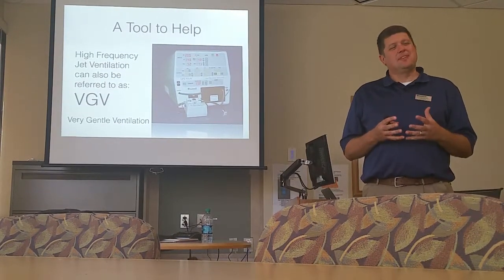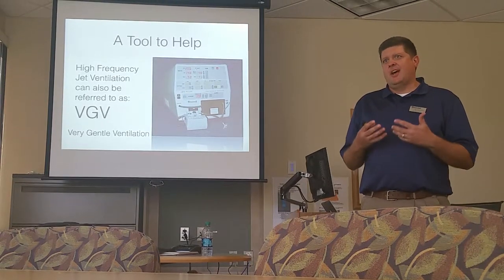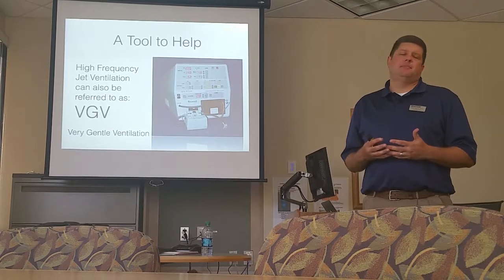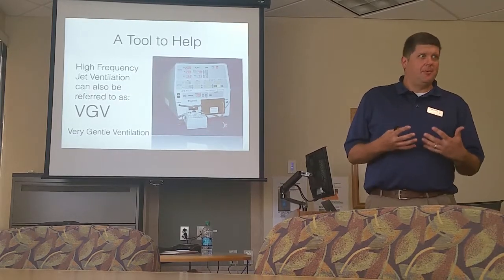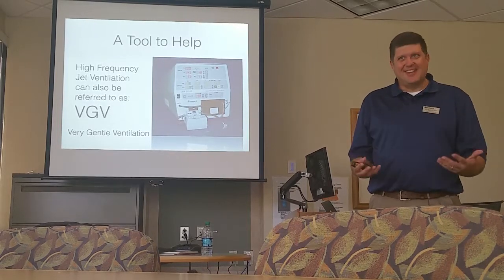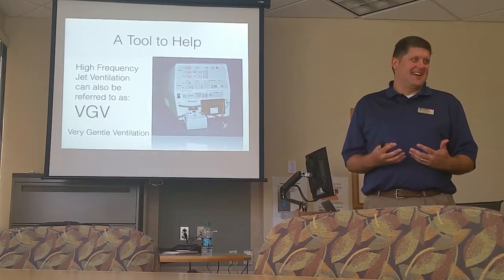I mean, that's what high frequency is. Jets and oscillators are very, very gentle. High frequency doesn't mean high stress, high anxiety, people freaking out. The reason it means that is because we put it on our sickest kids, right? That's why it means high stress, high anxiety.